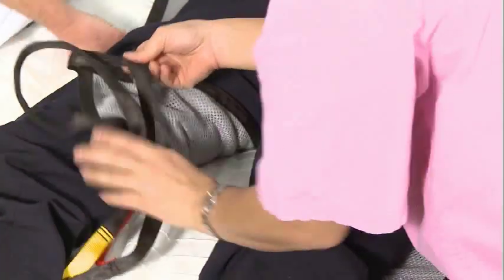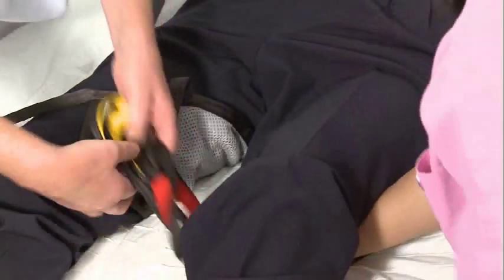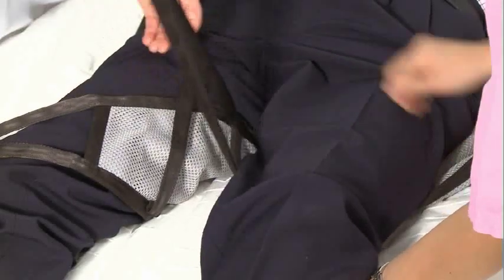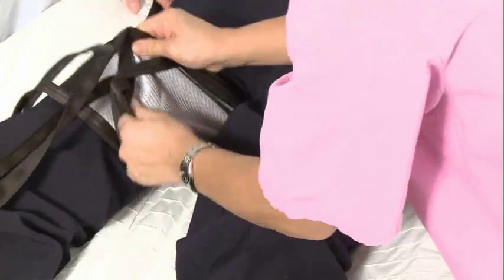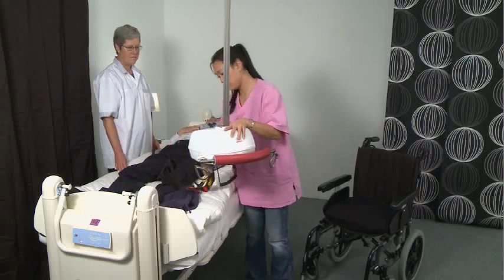Draw out the leg straps between the client's thighs. For a three-point lift, draw the left leg strap through the loop on the right leg. For a two-point lift, the leg straps are crossed as normal and the leg strap loops are connected to the hoist unit hook.